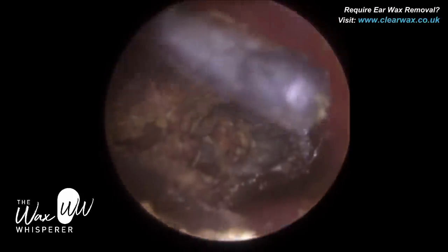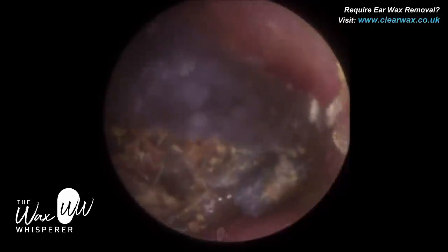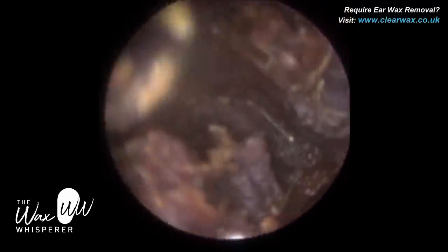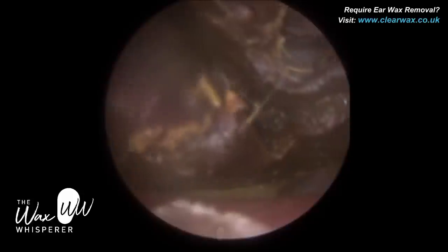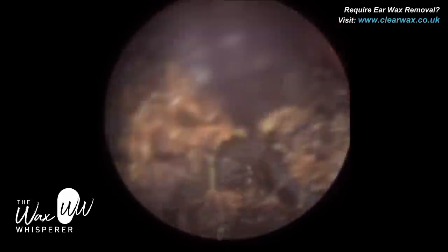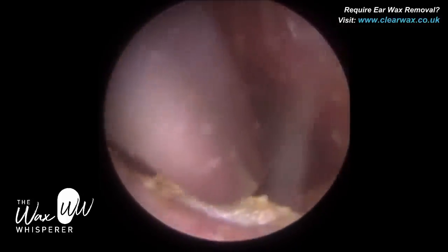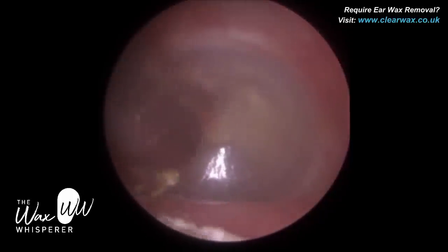Ear irrigation in the UK is far less invasive than ear syringing because you have control of the flow of water. However, in the UK, it's not the gold standard anymore — the gold standard for both professional audiologists and ENT specialists is suction or removing wax using mechanical instrumentation: ear hooks, jobson horns, crocodile forceps. A lot of GP practices in the UK no longer perform ear irrigation, and it's not a service provided on the NHS anymore. You can see me remove that final plug of wax and just mopping up.